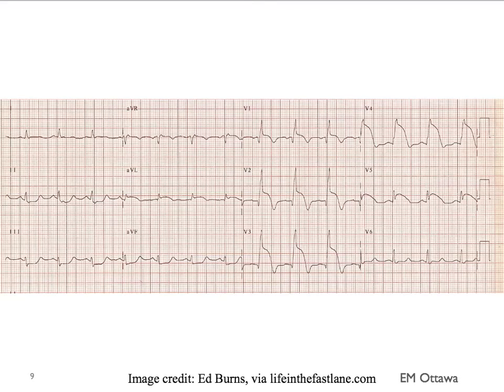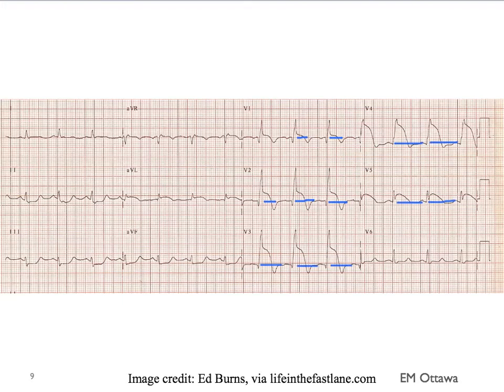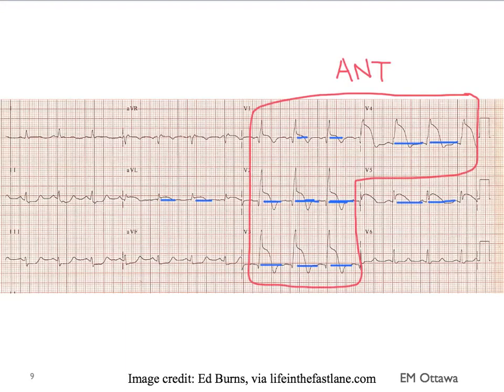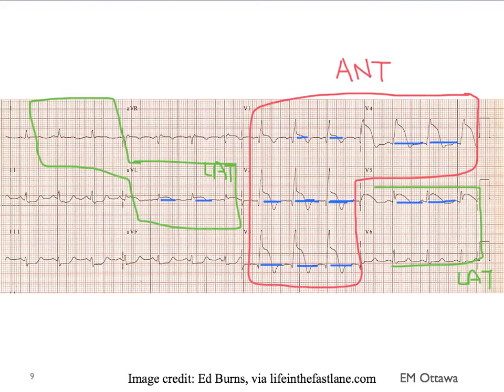We'll focus on ST elevations for now. Which leads do you see ST elevations? Lead V1, V2, V3, V4, and V5 are fairly obvious. There is also a very subtle ST elevation in AVL. So the question is: do the ST elevations belong to the same territories? They include the anterior territory and two of the leads in the lateral territory. Therefore, this is an acute anterolateral myocardial infarction.